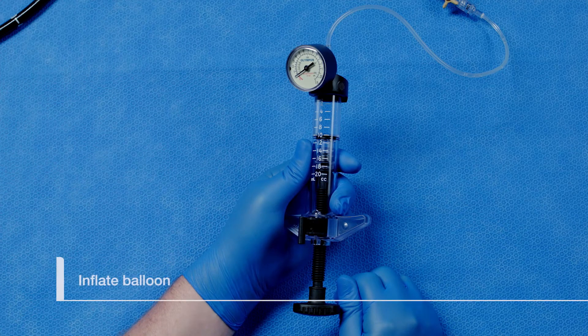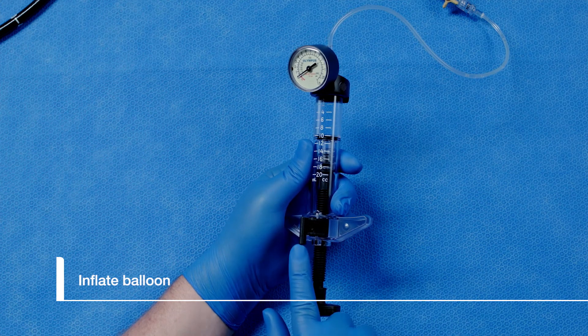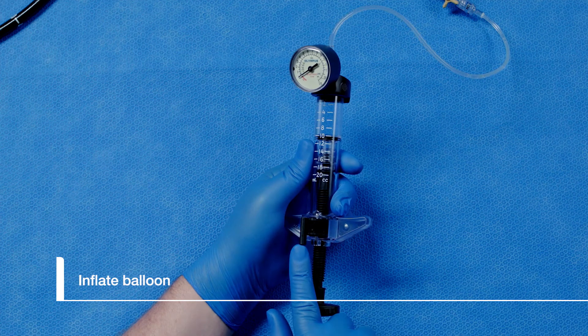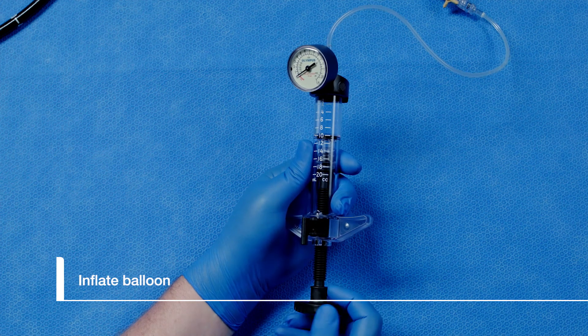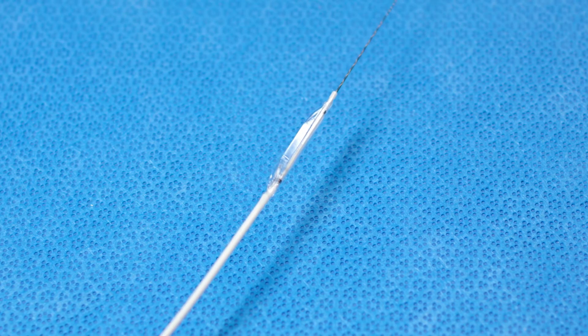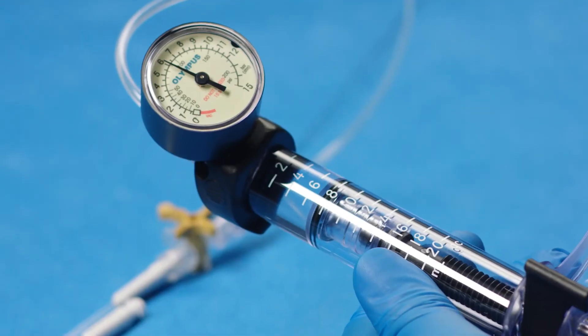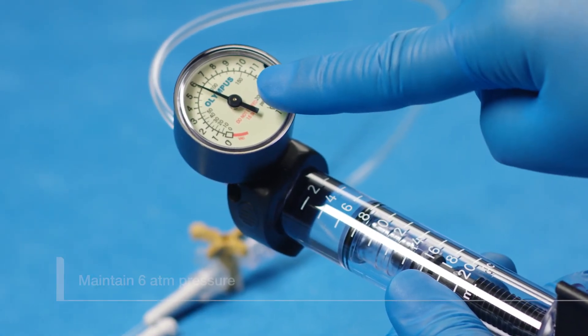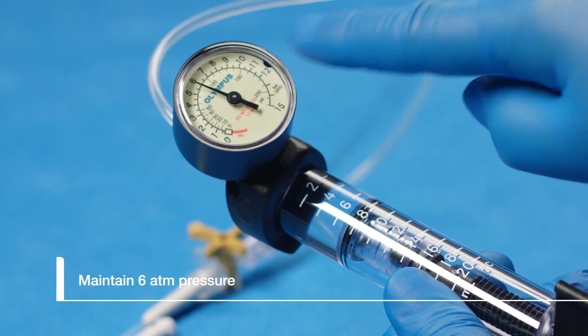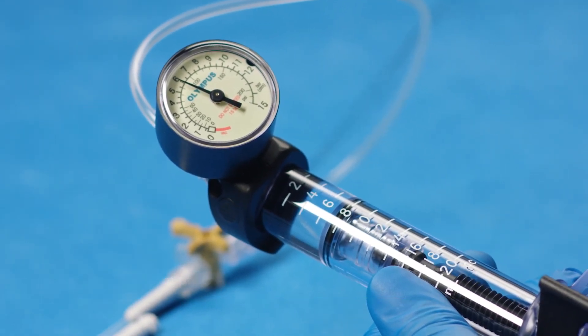Now that the balloon is in position, we can inflate. Flip the locking switch on the inflator to the center position. Slowly rotate the plunger clockwise to inflate the balloon. Rotate the plunger until the pressure in the balloon reaches six atmospheres. You will need to periodically adjust the plunger to maintain six atmospheres during dilation.